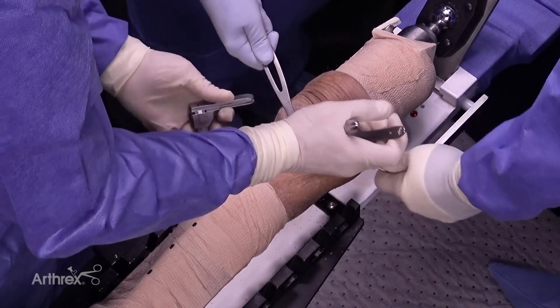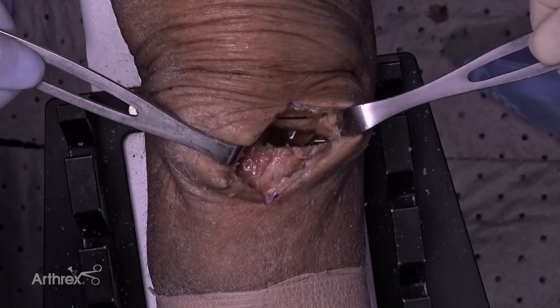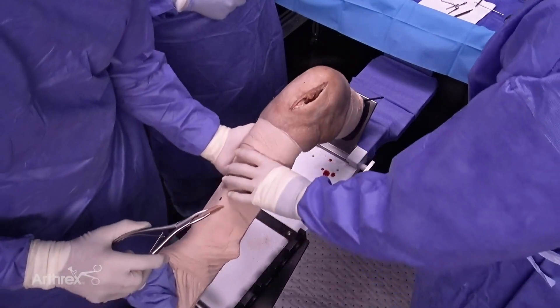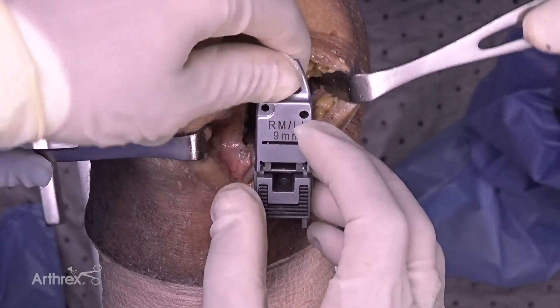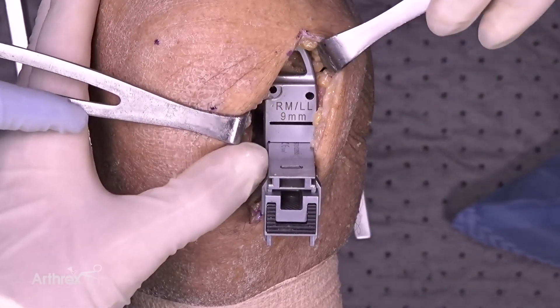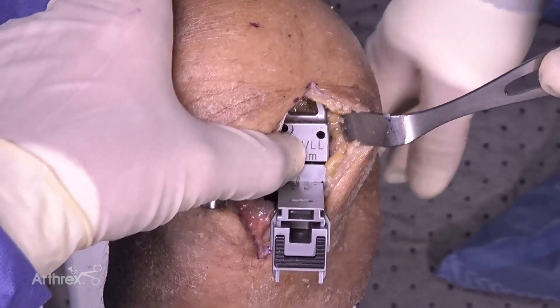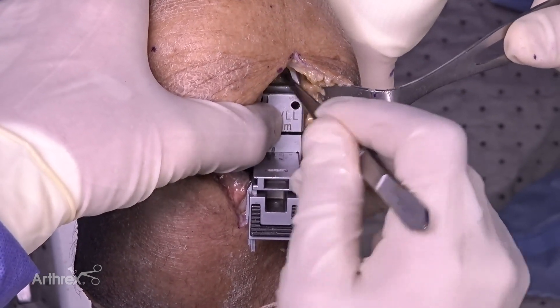Once that's completed, I can take out my spacer and cutting guide. With the guides out, you have better visualization. There may be a little bit of bone that needs to be continued to be cut, which can easily be done with this exposure. We flex the knee back up in order to get back to our flexion space. I'm going to use a posterior femoral cutting guide — this slides over the slots in the spacer block and sits down right on the flat distal femoral cut. It's important that this fit flush, and the way it will fit flush is a variance of flexion and extension.